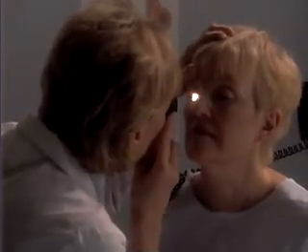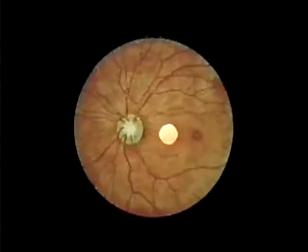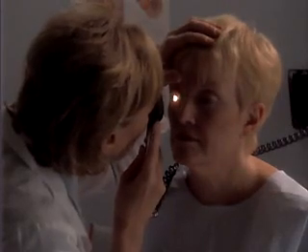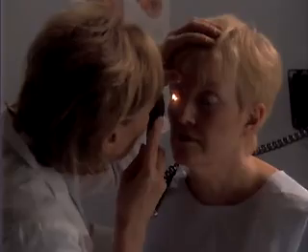Finally, examine the fovea and surrounding macula by directing your light beam laterally or asking the patient to look directly into the light. The tiny, bright reflection at the center of the fovea may help orient you. To focus on more anterior structures, such as opacities in the vitreous body or the lens, change the diopter on the ophthalmoscope to more positive numbers, such as +10 or +12. Repeat the ophthalmoscopic examination on the patient's left eye, using your left hand and left eye.